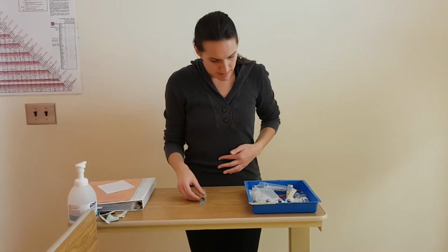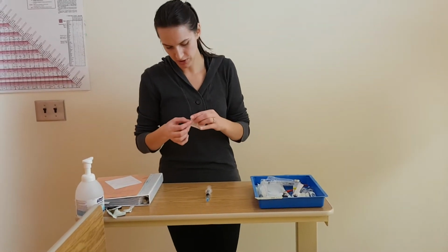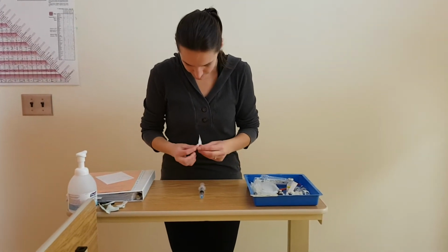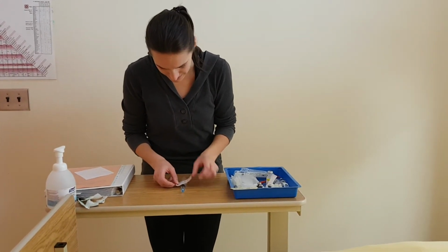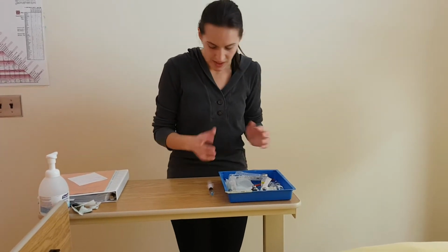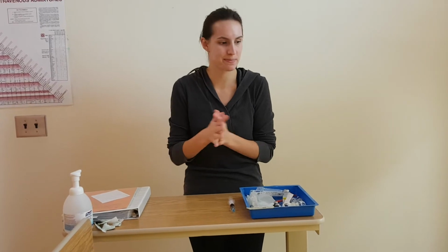So now that I've prepared my medication, I have a label here, and I'm going to attach this label to the syringe. Get the bubbles out just to make sure that I do have the correct amount of sterile water in here, being careful not to cover any important information. Okay. So at this point, I am ready to go to the patient's bedside. I have my medication and all my needed supplies. 4.8 milliliters of sterile water.